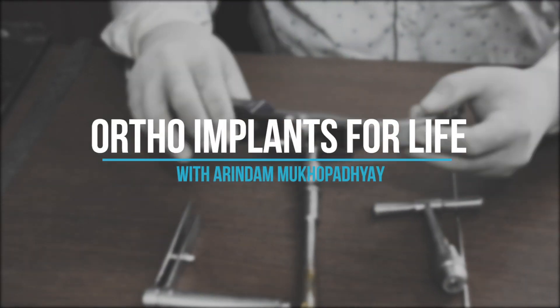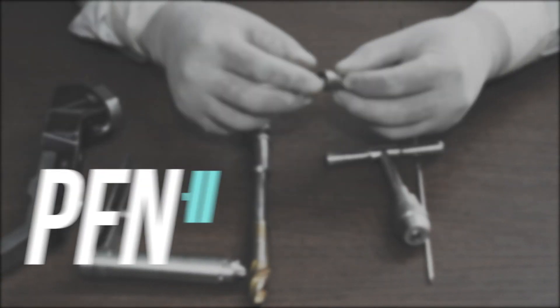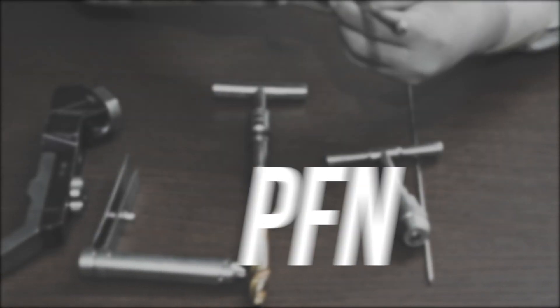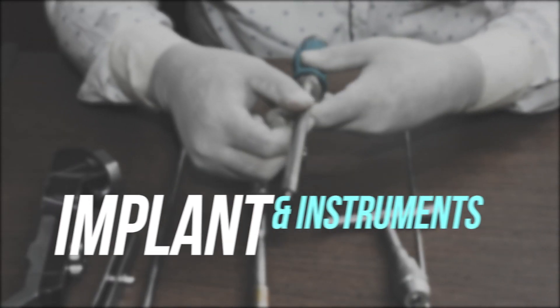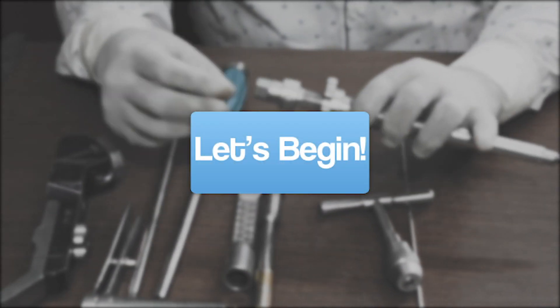Hello everyone, welcome to Ortho Implants for Life. Today we will discuss PFN A2, or Proximal Femoral Anti-Rotation Nailing implants and related instruments. So let's begin.